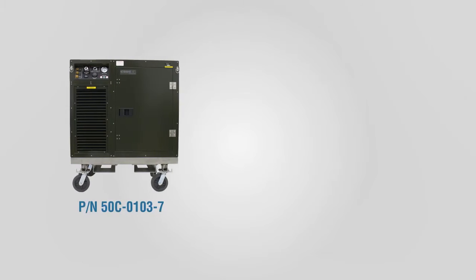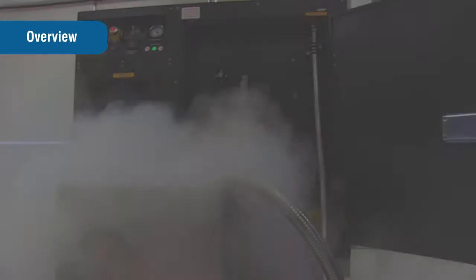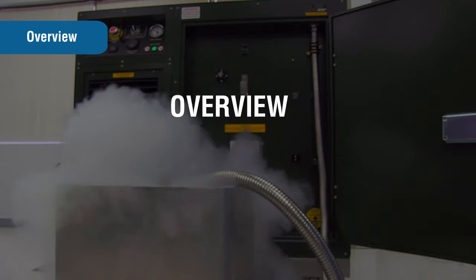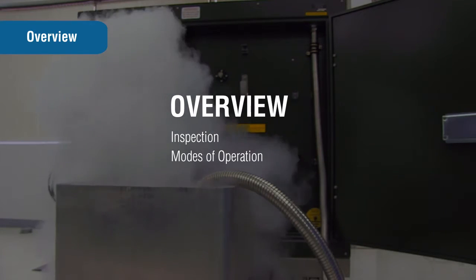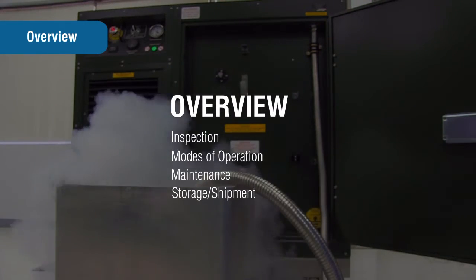The OGL is available in olive green or desert tan. The following information provides a general overview of the equipment and covers the inspection, modes of operation, maintenance, and storage or shipment of the OGL.